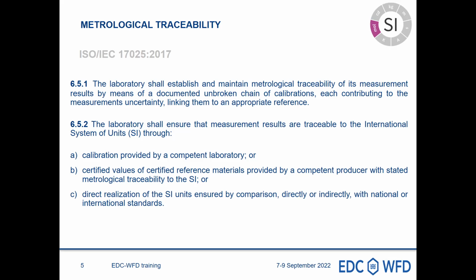It also mentions that the laboratory shall ensure that measurement results are traceable to the International System of Units, SI, through calibration provided by a competent laboratory, certified value of a certified reference material provided by a competent producer with stated metrological traceability to the SI, or direct realization of the SI units ensured by comparison, directly or indirectly, with national or international standards.